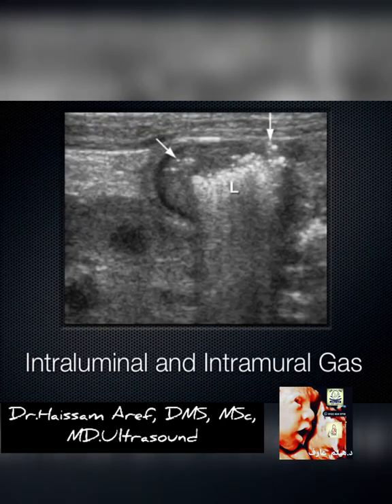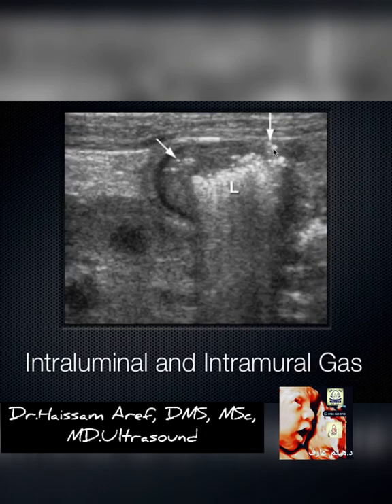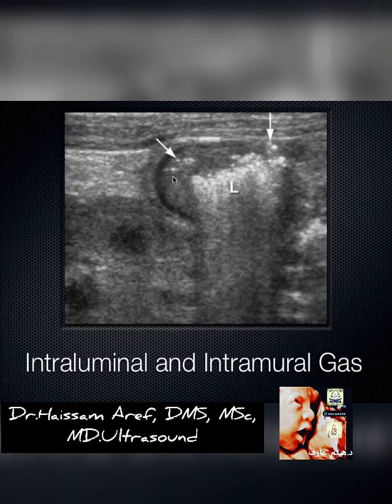Here's a mixed picture: we see intraluminal gas, which is normal, and in the wall we can make out punctate areas of intramural gas. There's also wall thickening here — if I measure from the lumen out to the edge of this wall, it's more than 4 millimeters, looking like almost a centimeter of thickness. So we know this is a disease state, and indeed this patient has air in the wall of their bowel.